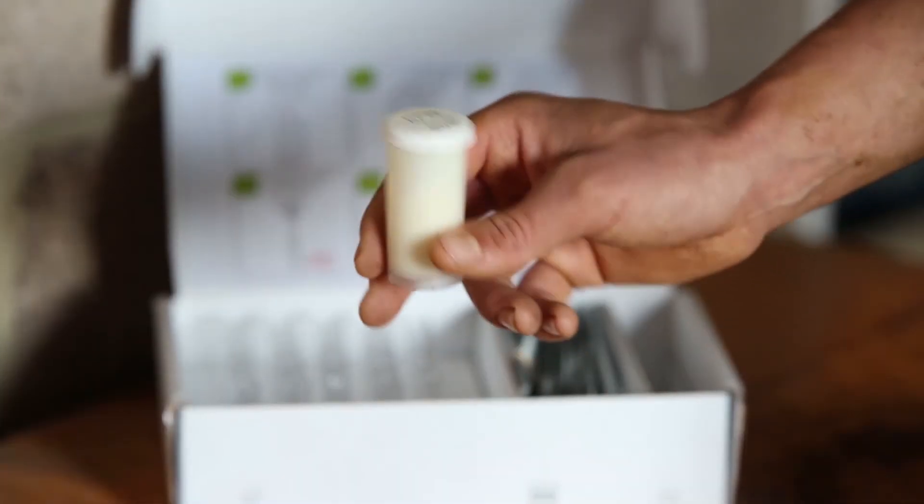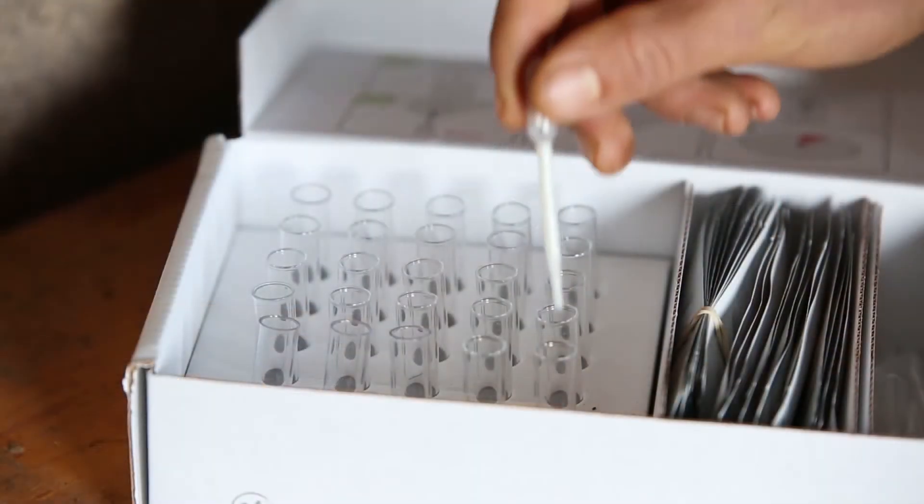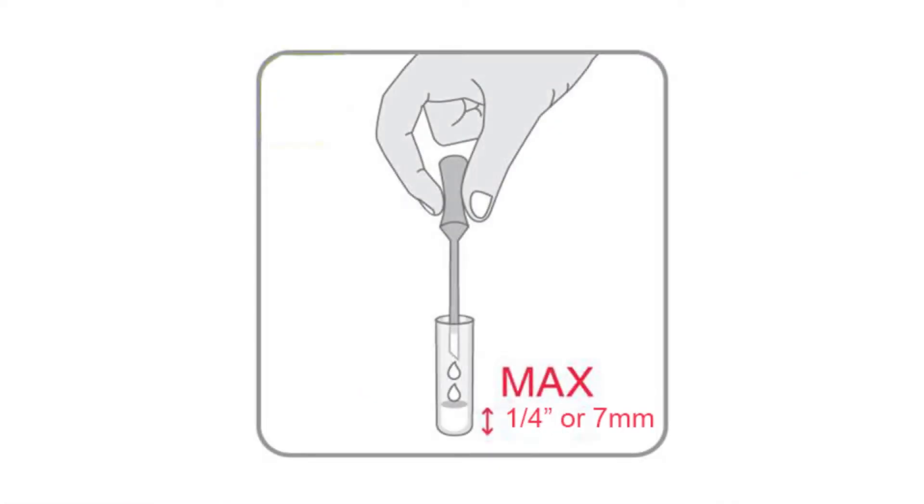Mix the milk to distribute the fat. With a clean pipette, drop some milk into the bulb and transfer it to a test tube. Make sure the milk is no more than 7mm deep, as the red part of the stick must stay dry.